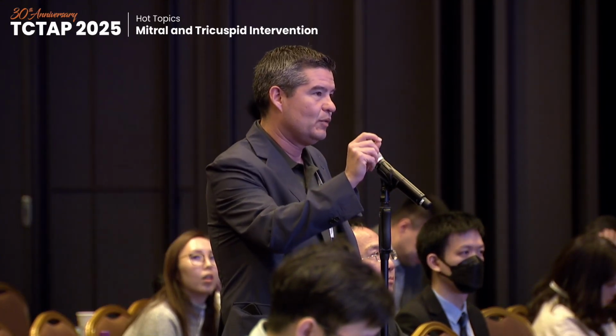In all the studies, SLDA dislodgement of the clip happens especially in those cases. This is not really evidence-based medicine, but operators try to stabilize the first clip when you have a very long anterior leaflet or mitral valve prolapse to avoid exactly that. Or if you are not sure about the leaflet insertion, did you grab enough of the tissue? That could be another reason to implant a second clip.